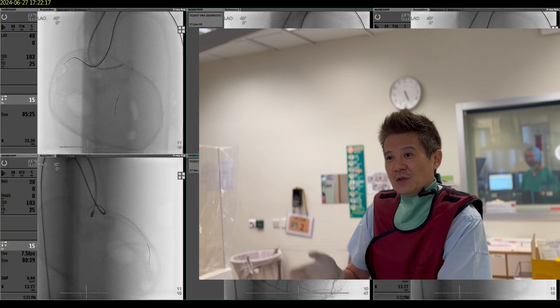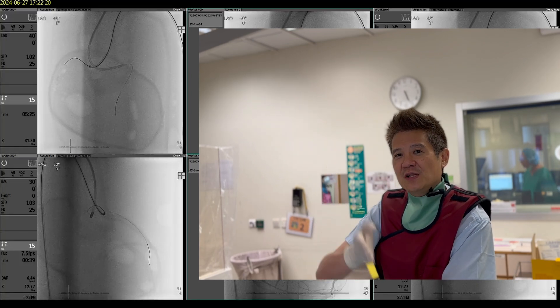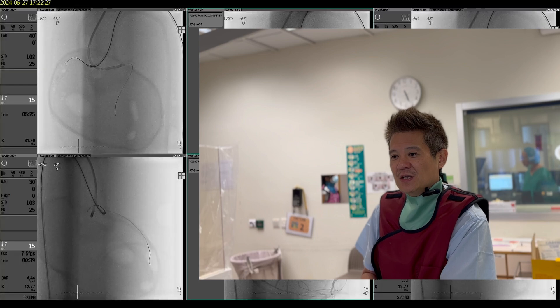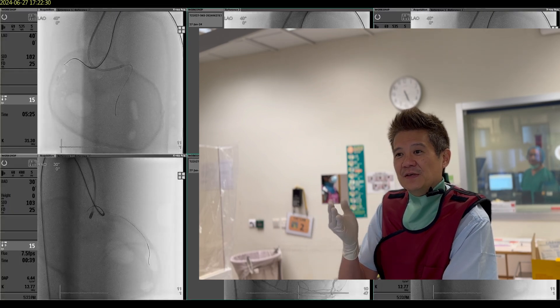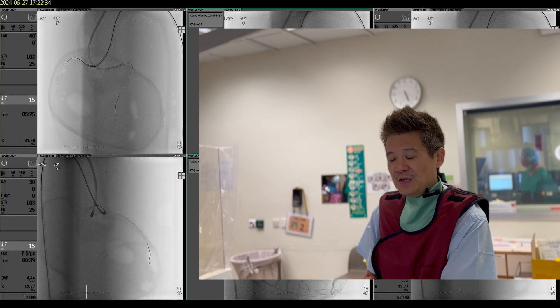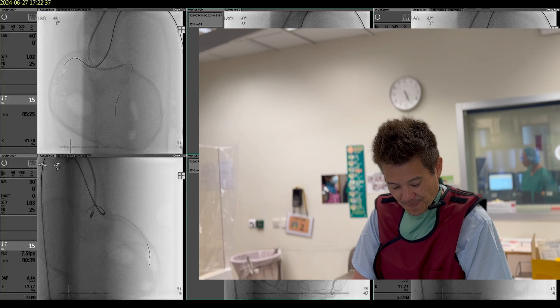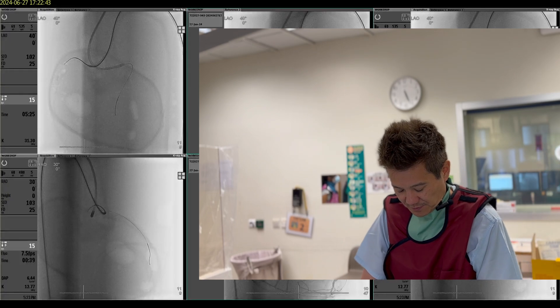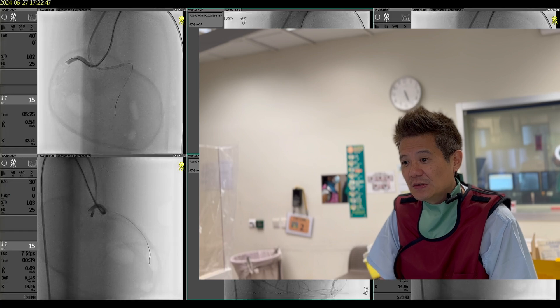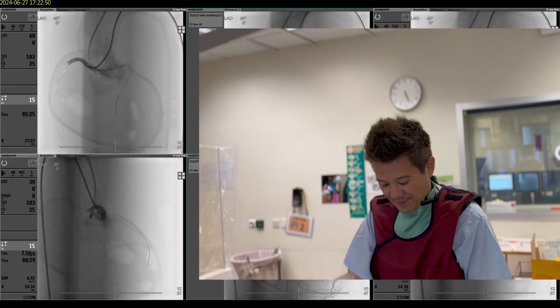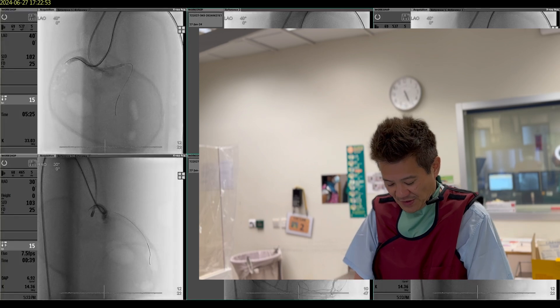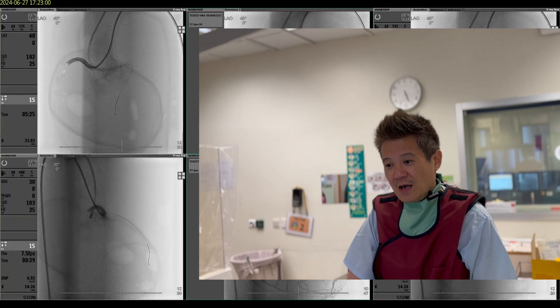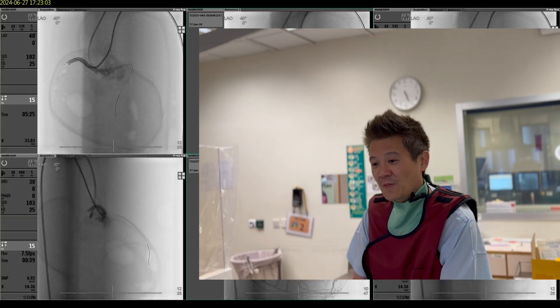In both views our target is an imaginary line at the center of the CTO between the proximal and distal cap — that's our target. We can see now that the wire is very much on the edge of the vessel. A quick antegrade injection shows it's both near quite the distal cap — both quite near the distal edge of the vessel. It doesn't matter which view is the far view or near view, but since in the RAO view our wire tip is pointing towards the target, we're going to call that the far view.